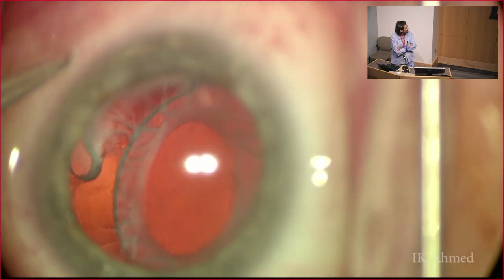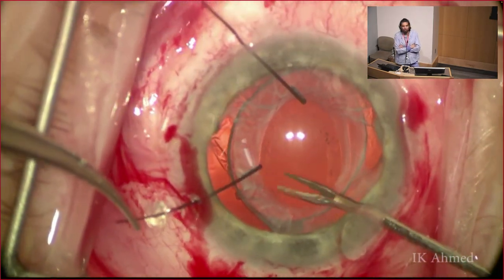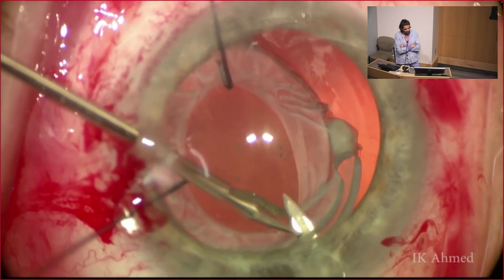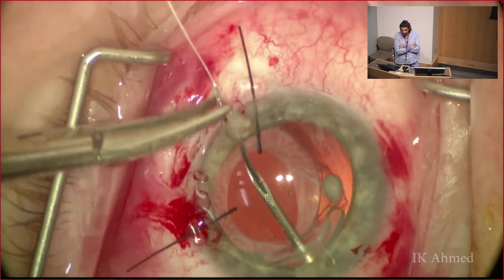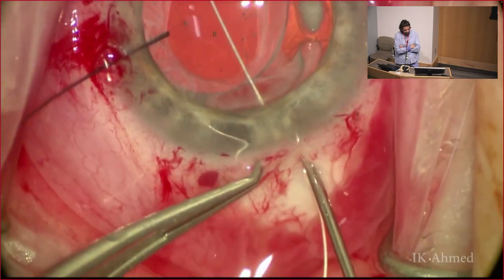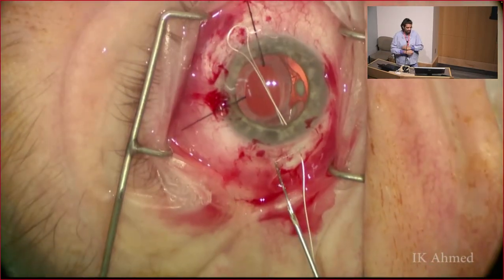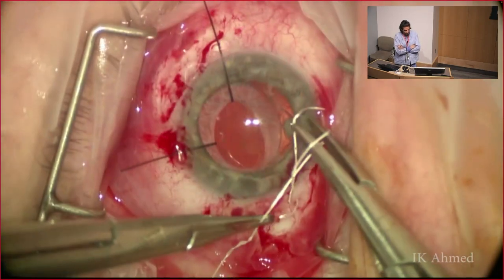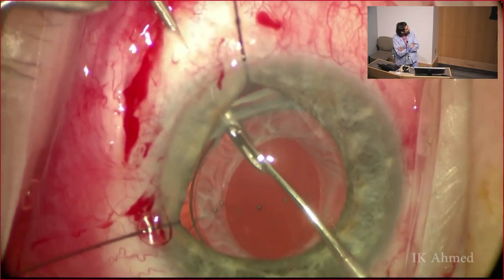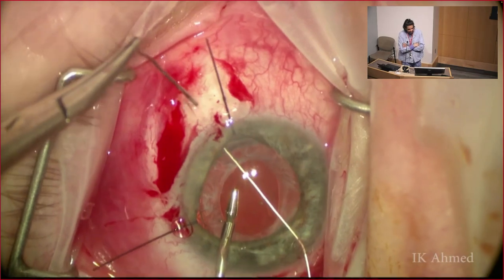This is just an example of that one-piece lens in the bag. Despite probably the chagrin of some, there is rarely vitreous prolapse. These are typically, if you catch them early enough, sitting on the anterior hyaloid. With a couple of iris hooks supporting the capsular bag, the rhexis is a great place to support the IOL temporarily with those hooks. We can support it there, and then make that radial incision, centering it again on that 1.5 from the posterior blue zone or 2.5 from the limbus. These are again placed a millimeter and a half to 2 millimeters apart. Gore-Tex is our preferred suture, and we again pass that needle mid shaft or toward the haptic-optic junction. It's important, of course, to have them 180 degrees apart, and it's a very elegant, very straightforward technique.